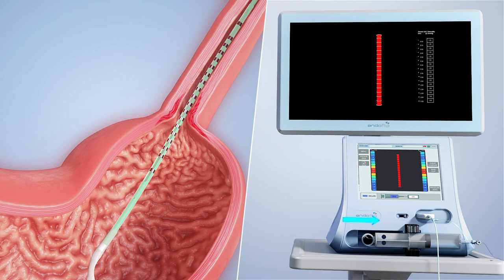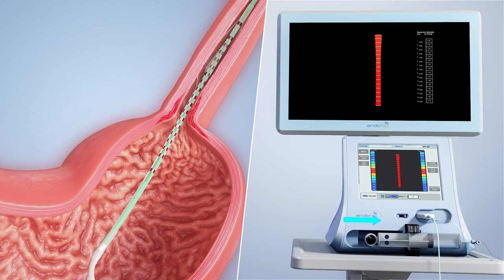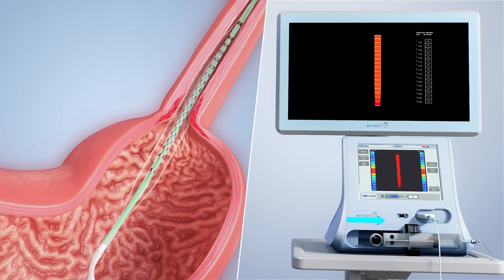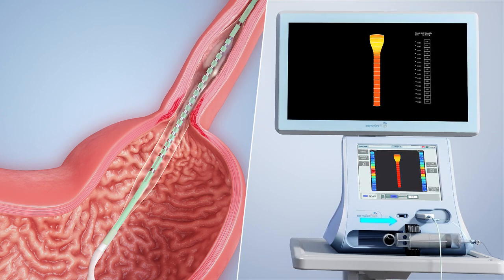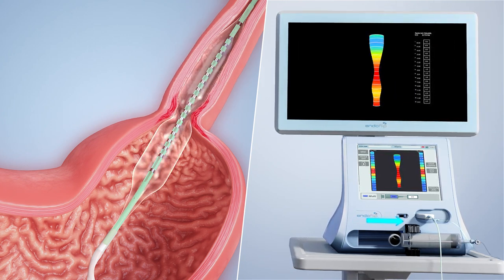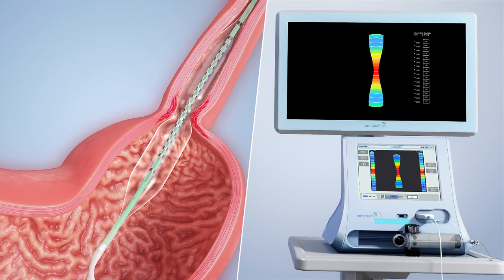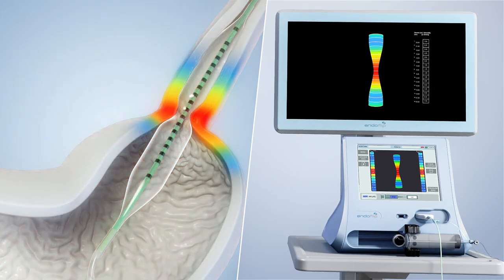Then the balloon is filled with a specially formulated saline solution. As the balloon volume increases, the integrated sensors capture dimensional data of the measured area, and the data is converted into a series of real-time images.